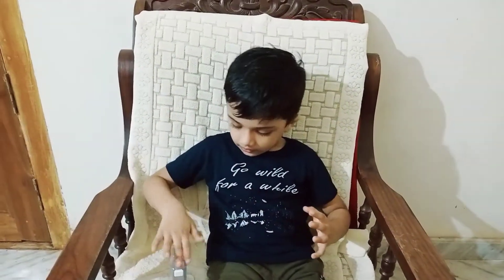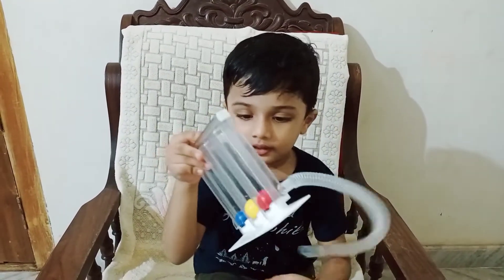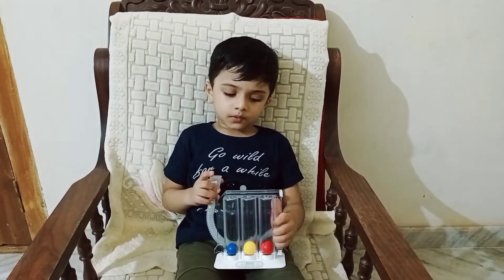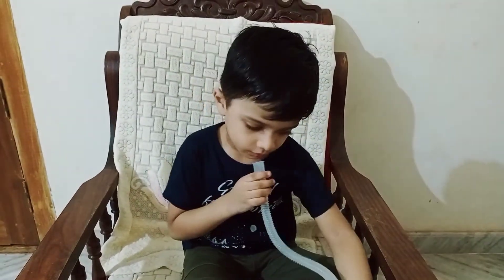Then we start your exercise. You don't have to do what you are doing. You have to do my left hand. No, you have to do my left hand. You have to do your left hand.